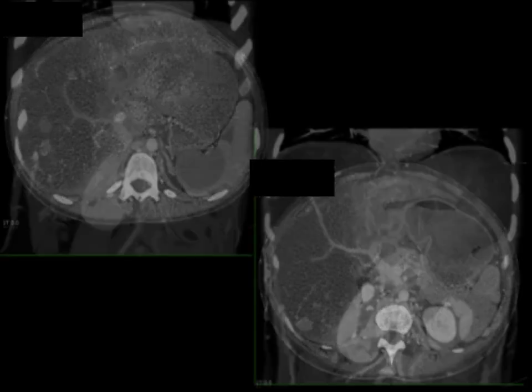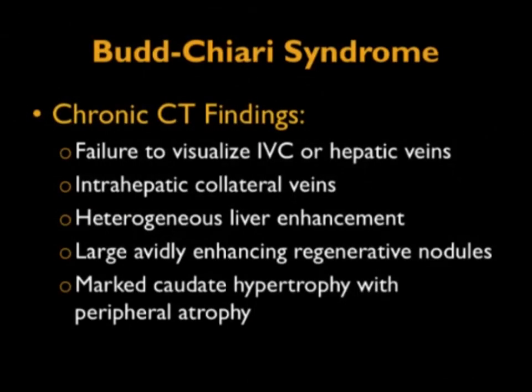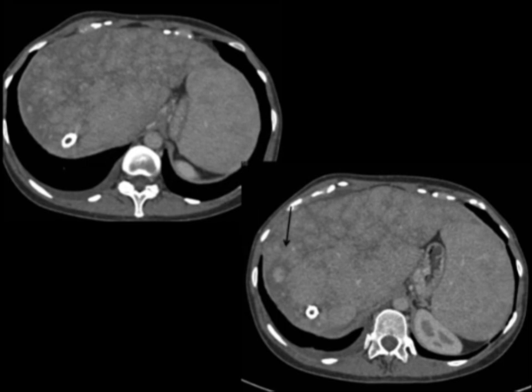You can see the right lobe again with multiple nodules. With Budd-Chiari you may see multiple too-small-to-count nodules, though that's less common. When Budd-Chiari is chronic, you may have failure to visualize the IVC or hepatic veins, intrahepatic collateral veins, heterogeneous liver enhancement with large avidly enhancing regenerating nodules, and marked caudate hypertrophy with peripheral atrophy. Here's a case with a TIPS catheter and a vascular lesion — is it a hepatoma, regenerating nodule, FNH, hemangioma? These were regenerating nodules.